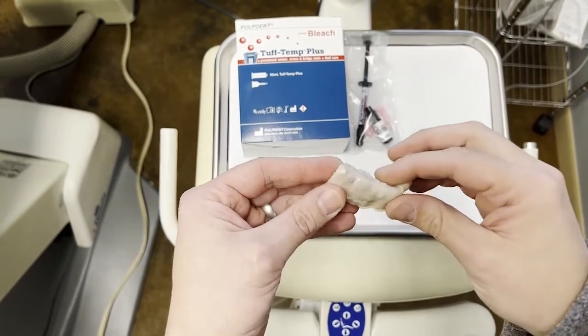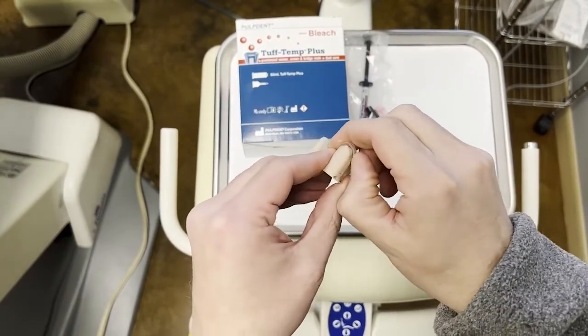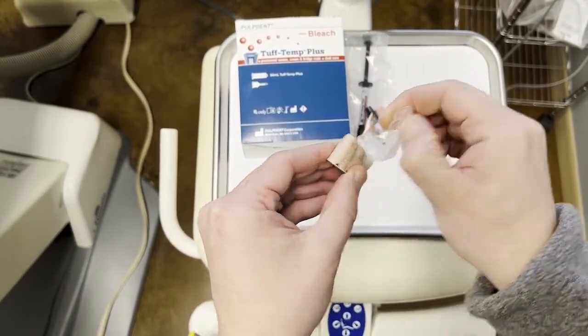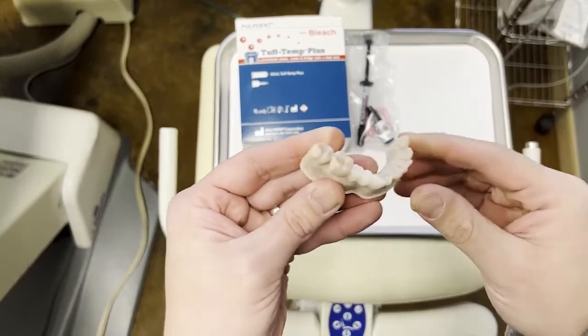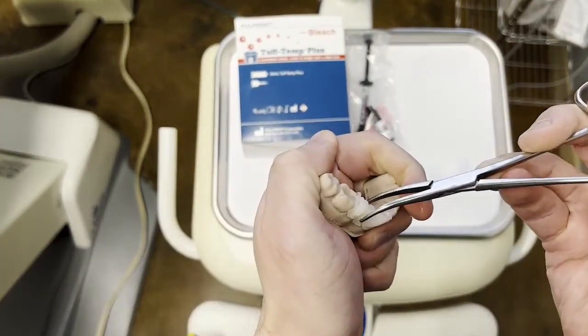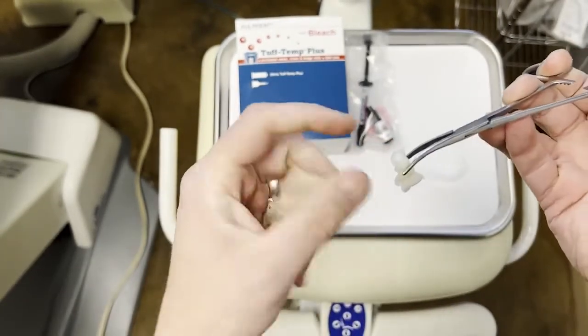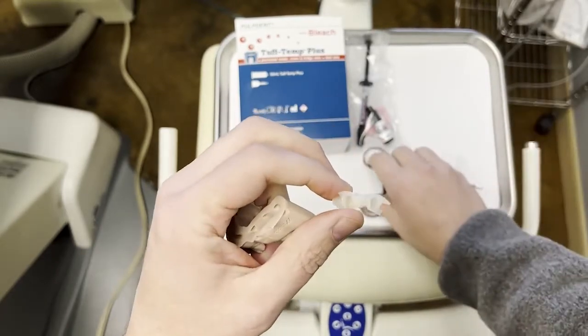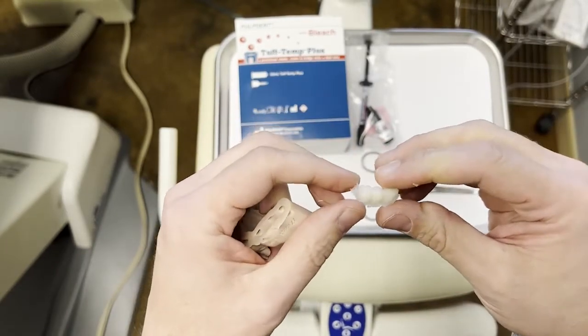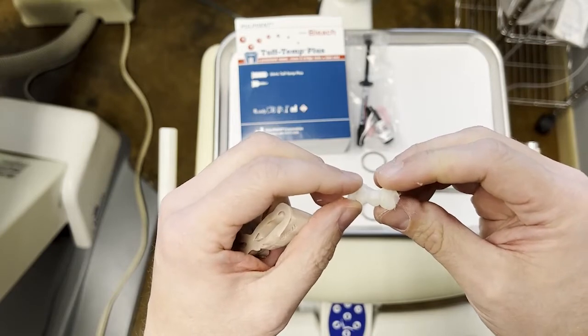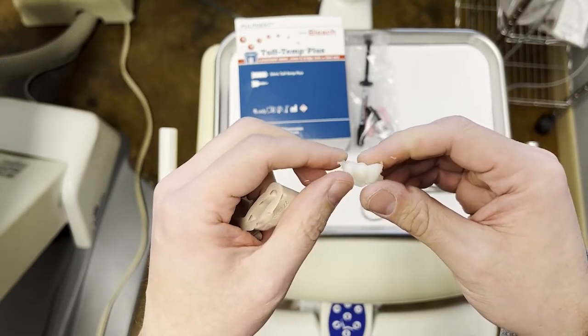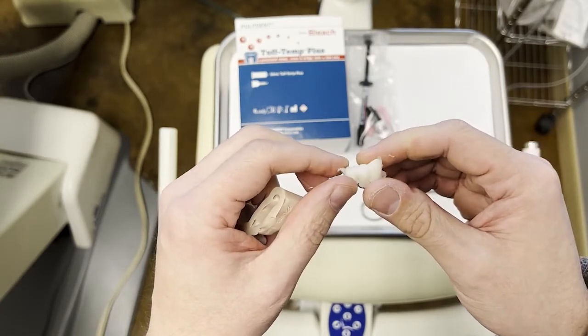Now we're ready to remove our matrix and then work the provisional off of the tooth. There we go. So now we have our provisional started and now we just need to start trimming this to get the best anatomical results possible.